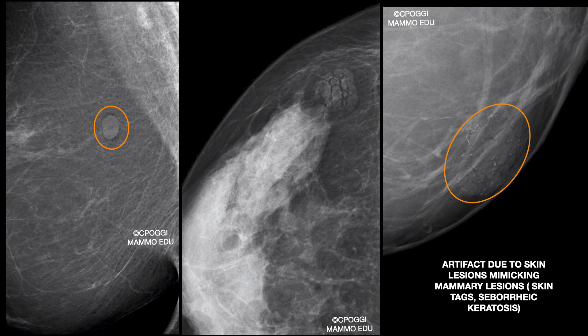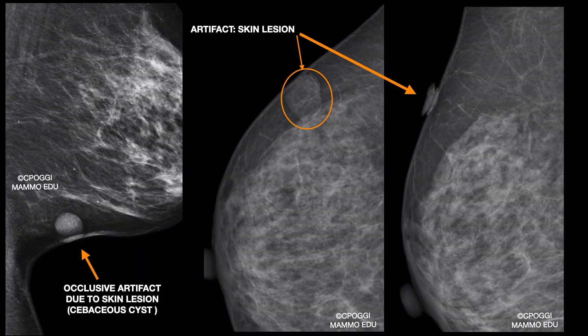These are skin lesions — we have to report them. Some of them are very recognizable on the image. A sebaceous cyst, like this one, could be visible. We can say there are occlusive artifacts able to hide tissue when they are large. The possibility to image them tangentially eliminates any doubts.